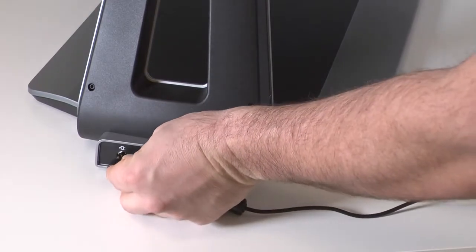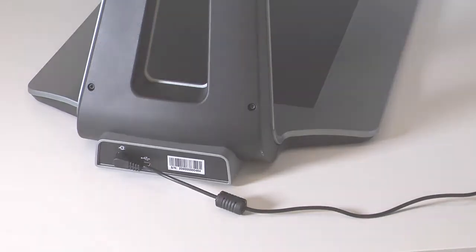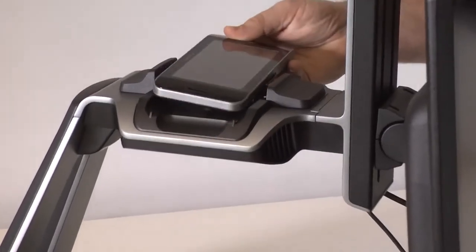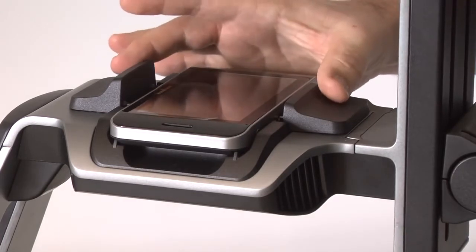Insert the connector into the backside of Prodigy and a few seconds later you will hear a beep. To dock the tablet, either tablet on or off, sit it in the cradle until it's secure and close the clasps.